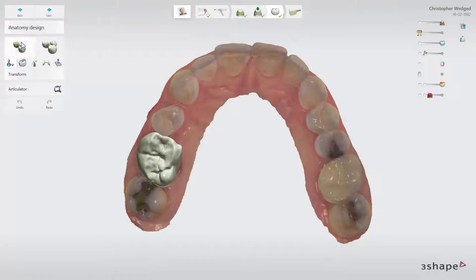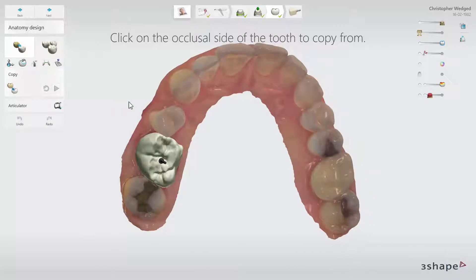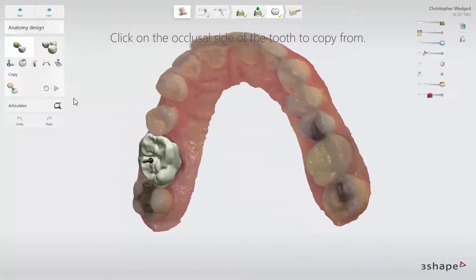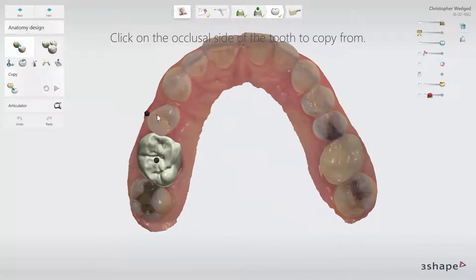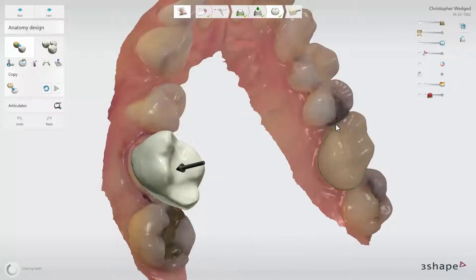First, let's look at copying a contralateral tooth. Simply click the copy button. You will be prompted to click on the occlusal surface of the tooth that you wish to copy. Move the black arrow over the contralateral tooth and click. This will create a line around the tooth that was selected, and what is inside this line is going to be copied.